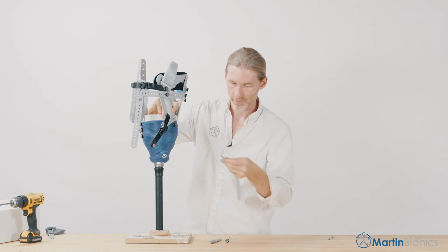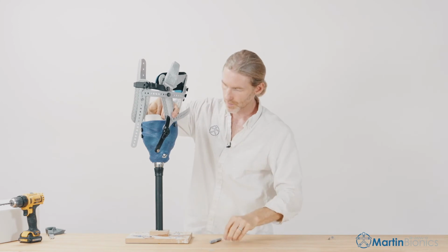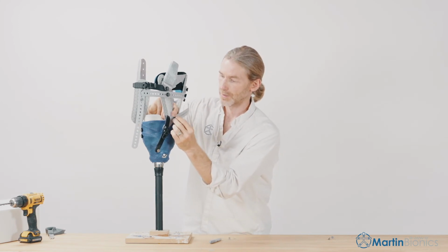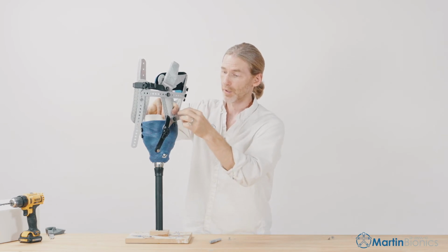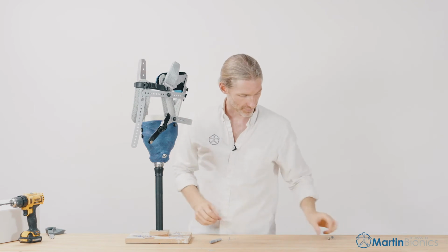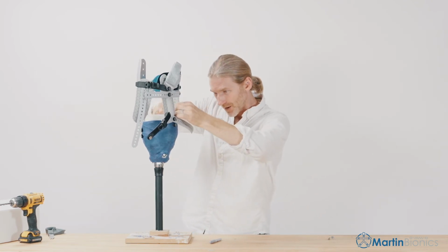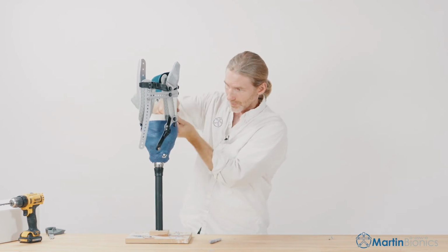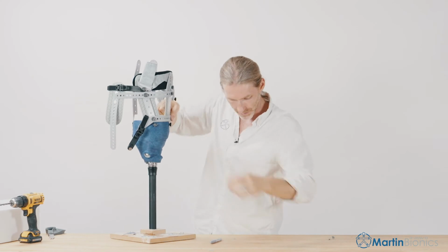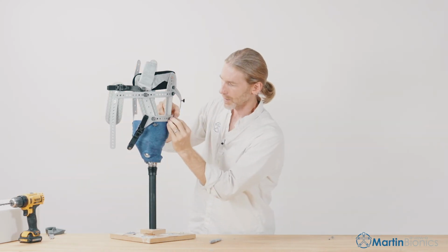Oh, put my cross connector back in line. This as well. So having this cross connector distally, or at the very least putting a truss nut through this bottom hole connection, it just gives a little bit more solidification to the system. Takes out some of the flex of the struts and really solidifies it nicely. So line this up, hole number 7, that's where that fits into. Put a thumb screw in.